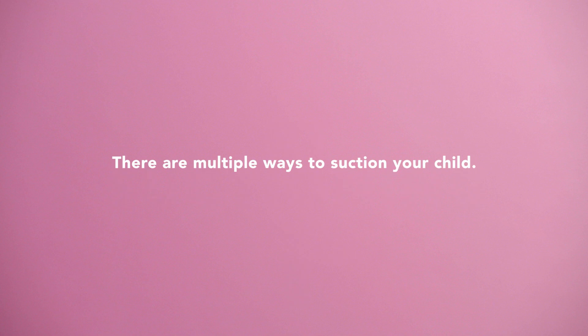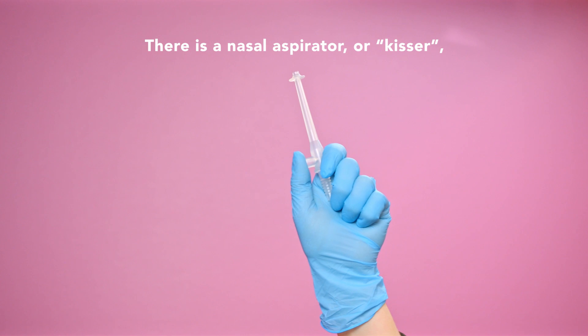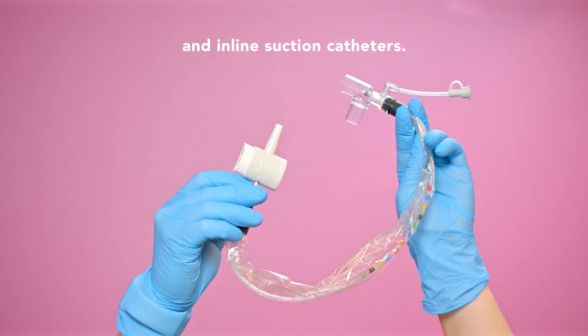There are multiple ways to suction your child. There is a nasal aspirator or kisser, oral suction catheters, sterile catheters, and inline suction catheters.